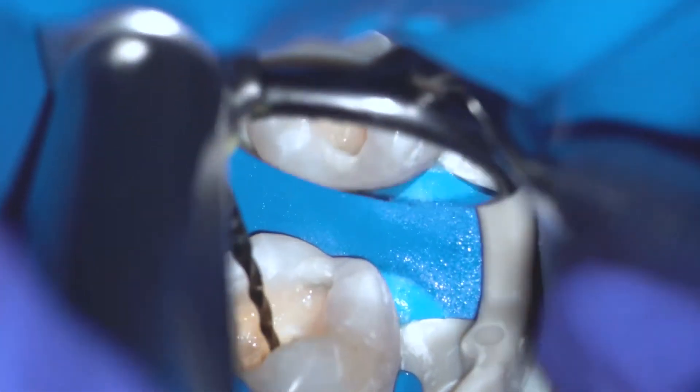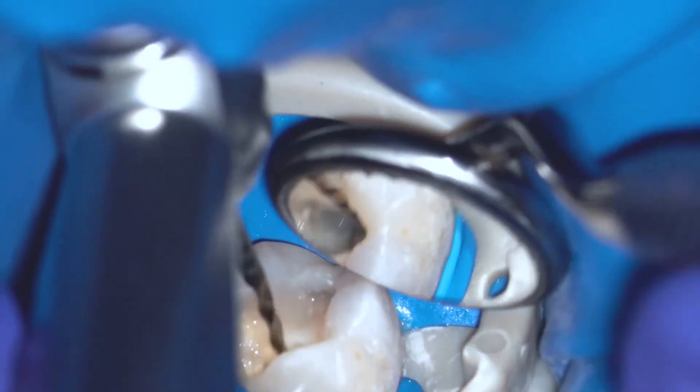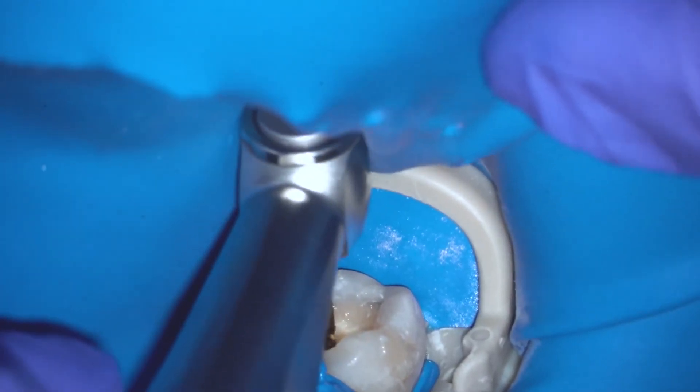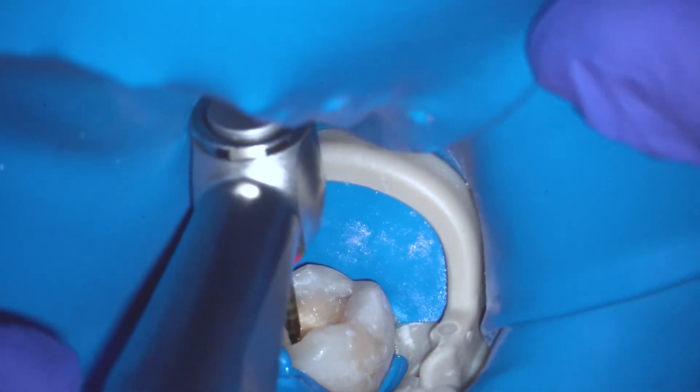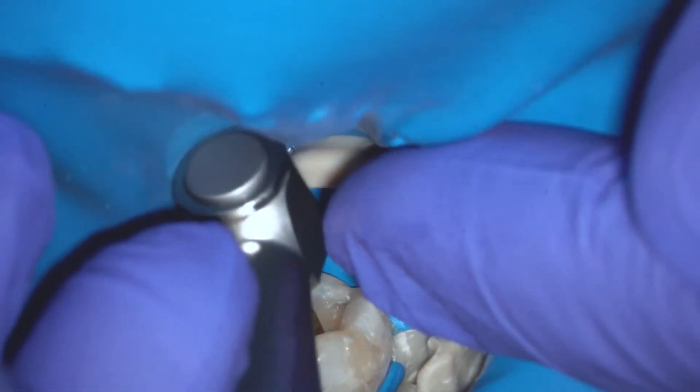In very narrow or extremely curved canals you can end up with the 2004, but this is only for extremely curved canals. In most typical canals — for example like the lower molar that I'm shaping in this video — you can use the 2506 as your master apical file, or the 3504 if you wish.